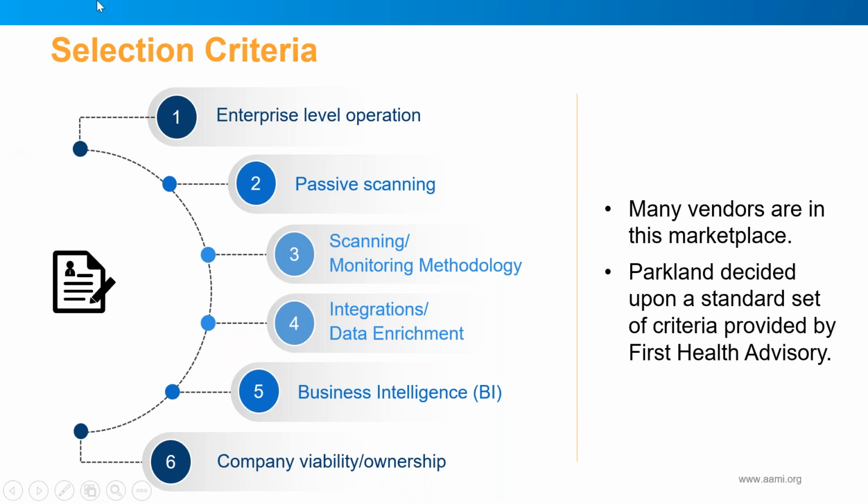There's a lot of information coming in from our medical devices that historically we've had to manage all that manually. We've had to go out, put our hands on a medical device, see what OS it has, what is the latest software version, what is the latest security patching, so on and so forth. And we have roughly 35,000 medical device assets in our database. So managing that manually is next to impossible.